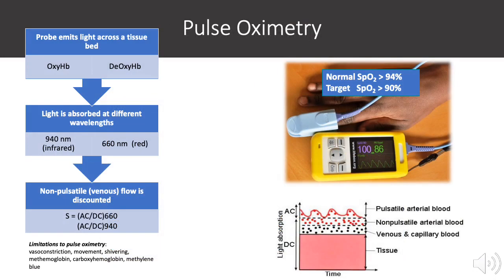Pulse oximeters have two components, a probe and a computerized unit. The probe is placed on the patient's finger or toe. In small infants, the probe may cover the entire hand or foot. The probe has an LED light and photodetector. The light is shown through the patient's tissues.